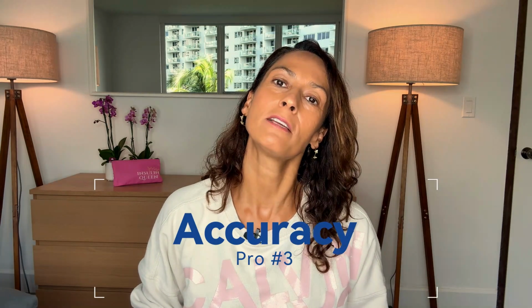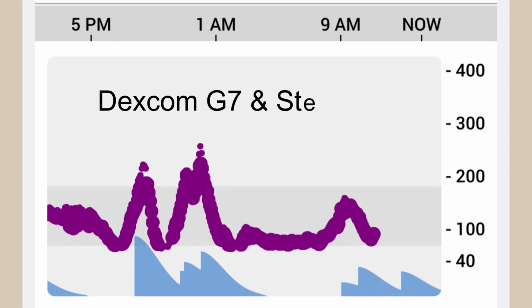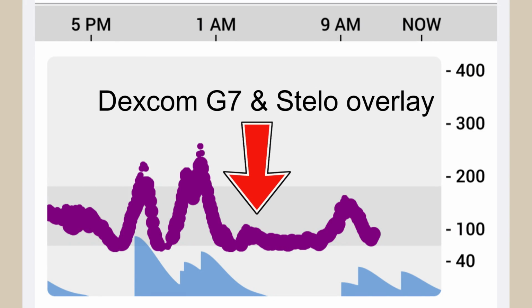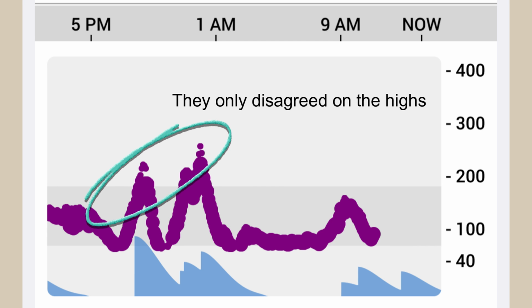When it comes to accuracy for biosensors or CGMs, that is measured in something called MARD, M-A-R-D, which stands for mean absolute relative difference, and the lower the better. To me, the accuracy seemed exactly like the Dexcom G7. I pulled both the Dexcom G7 and the Dexcom Stelo blood sugar readings into my InPen. I was wearing both at the same time. InPen is a smart insulin pen, and you can see here the readings are pretty much identical.